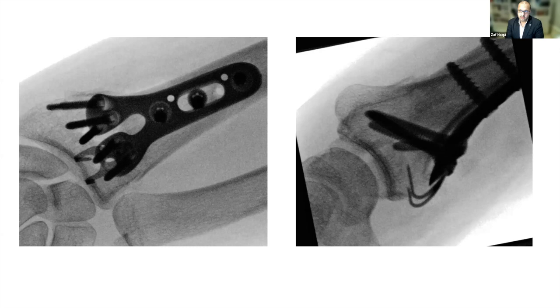It's just a problem I've always noticed, that fixed assembly is sometimes a millimeter or two too radial. Do you think we've discussed enough or highlighted the importance of the lunate fossa fragment and the intermediate column tonight? Because I'm always obsessed about looking at the DRUJ when we're doing the reduction and looking at that lunate fossa fragment. I'm happy if any of you want to chip in on the significance of that lunate fossa fragment being the keystone. For me, the first place I look is the lunate fossa and then build around that. Any comments?